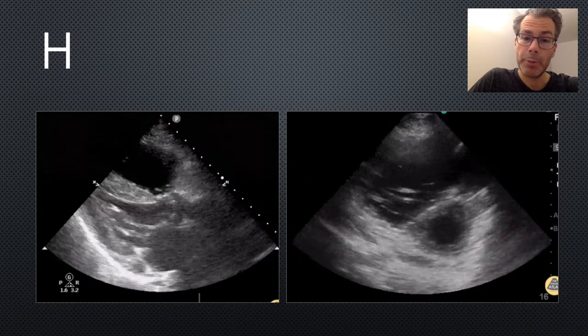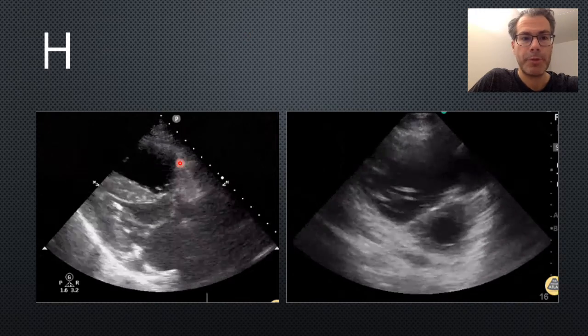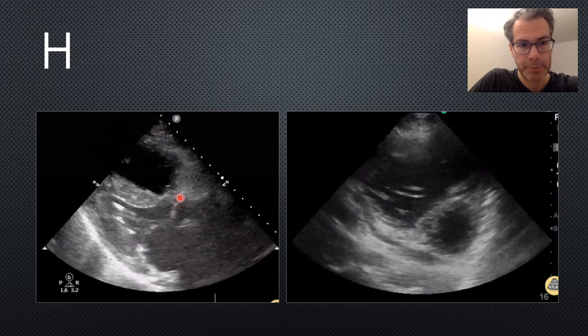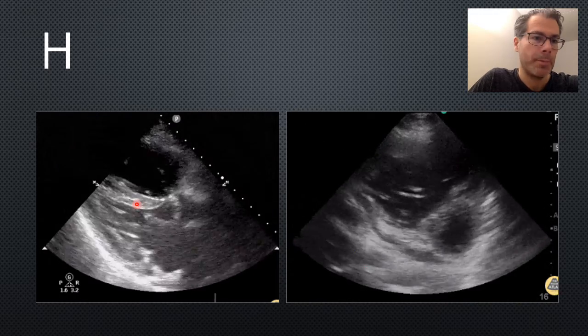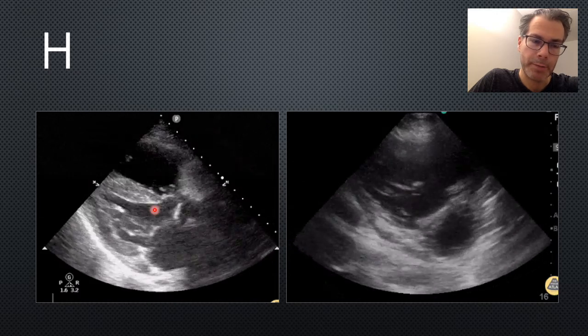So the second thing that we look for in terms of the heart and shock is RV strain. So in the first image, this is a parasternal long axis. So this is the RV, this is the LV, this is the LA, mitral valve, aortic valve, ascending aorta. And I'm sure you can appreciate this right ventricle is massively dilated. It's really crushing this poor LV down below it.